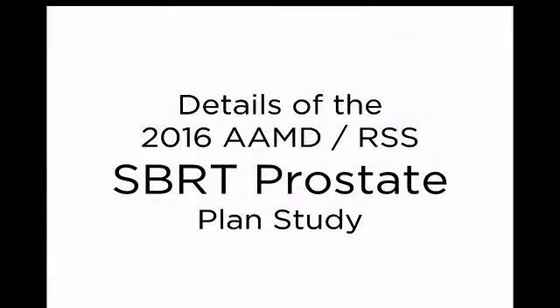And now finally, let's talk about some of the details of this particular plan study, which again is being done in conjunction with the AAMD and RSS meetings, both of which take place in June of 2016. And it's an SBRT prostate.